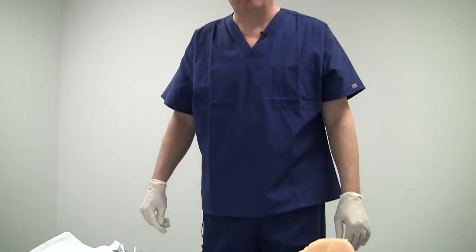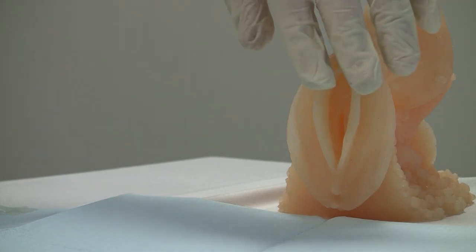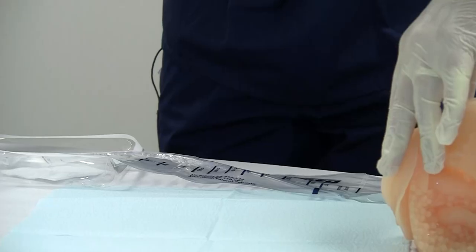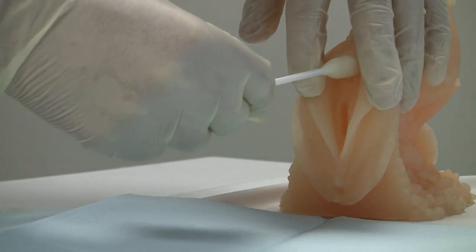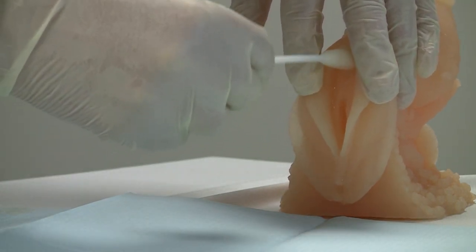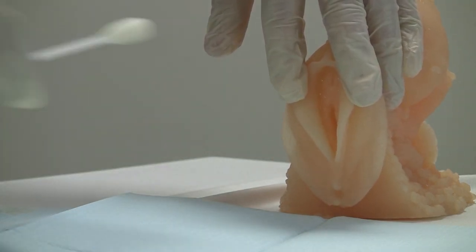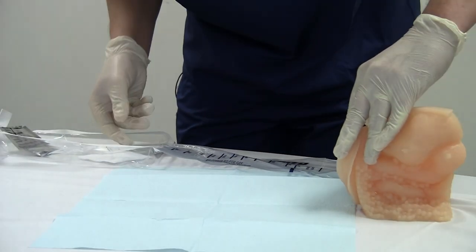I've gone ahead and donned my gloves, I've opened up the swab package and got them ready to go. And now, I'm going to go to the patient and I'm going to spread the labia with the two fingers of my left hand, just like so. And just like before, I'm going to use my right hand to do all the advancements. I'm going to take each swab and start right above the urethral opening and wipe downward one time with each swab. Don't retrace the same skin with the same swab stick. Again, there's no iodine, so it's less messy for sure.